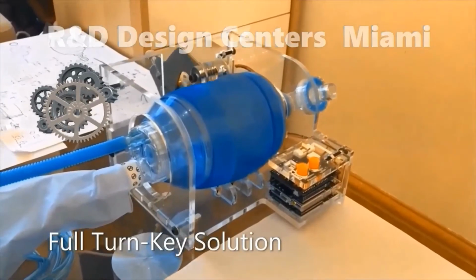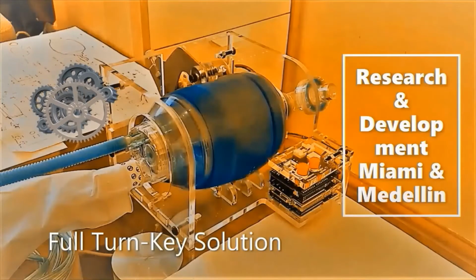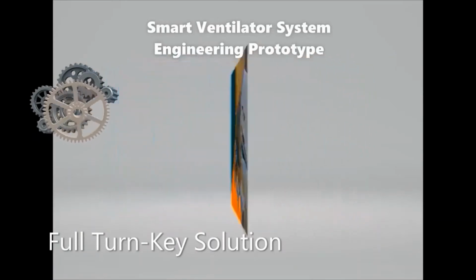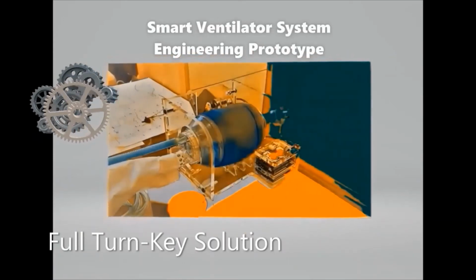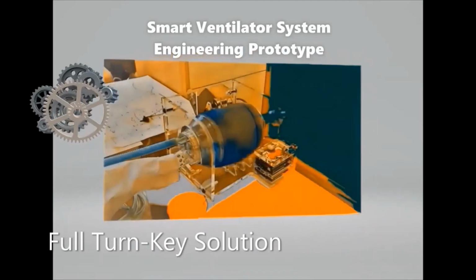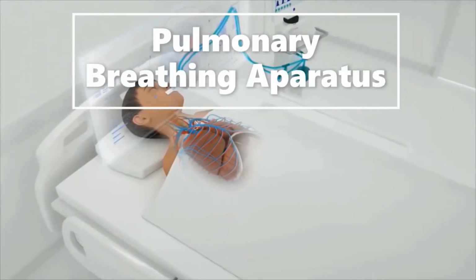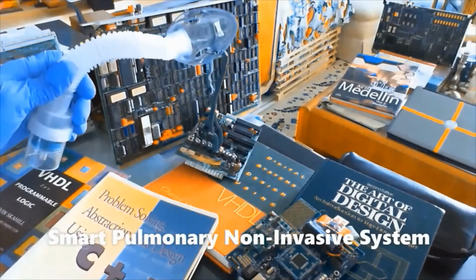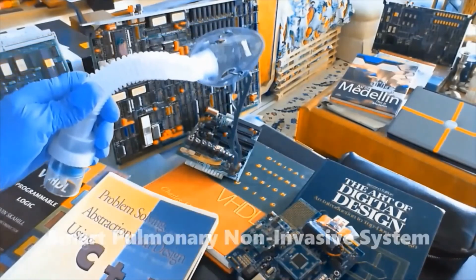The spirometer is an important feature to measure the airflow rate out of the BVM to calculate the amount and volume of air delivered, typically 200 milliliters of volume up to 750 milliliters.